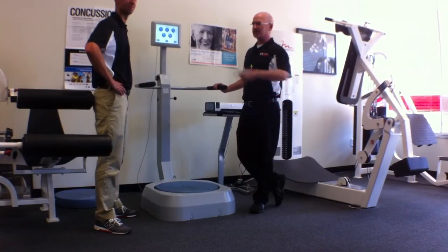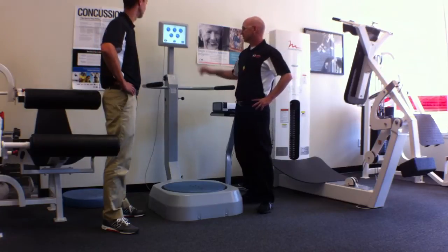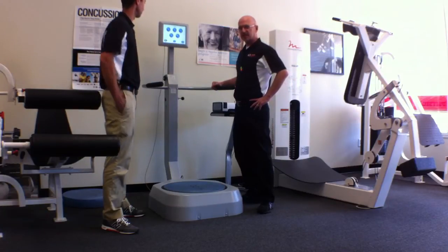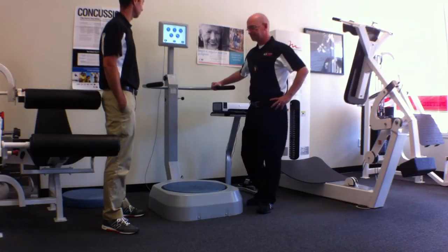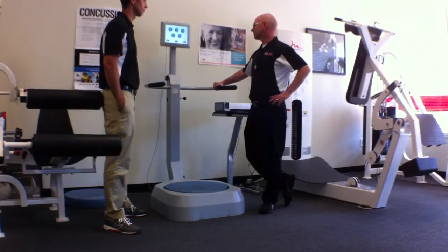Okay, I'm Eric. This is Peter here. We're going to go over a fall risk assessment on the balance system. We will probably be using this for health fairs or for other situations where you might want to check somebody's fall risk.